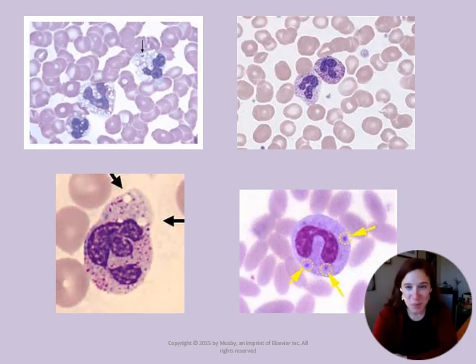Okay, here are some more pictures that we could look at, and I'd like for you to write down what you think you can see. Will you see these pictures again? It has potential. Maybe for your quick quiz, so maybe you could put those in your notebook and write those down.